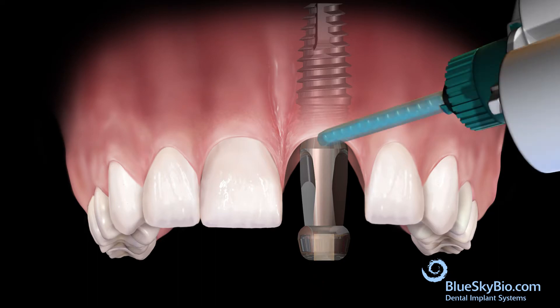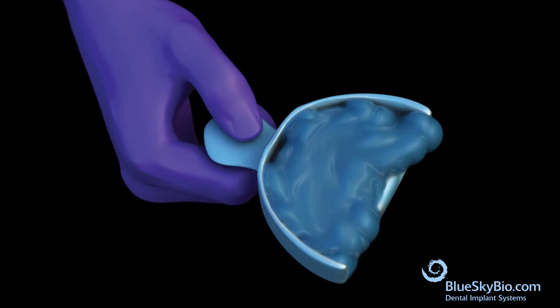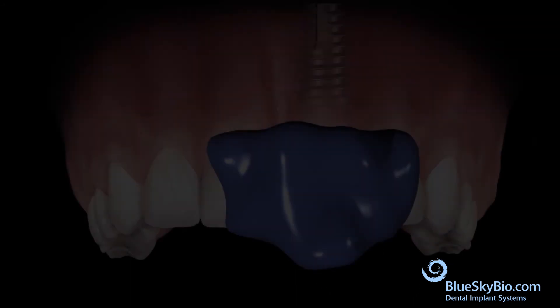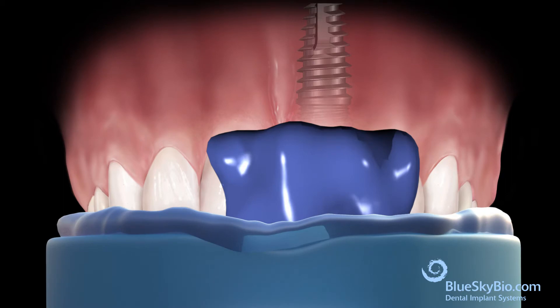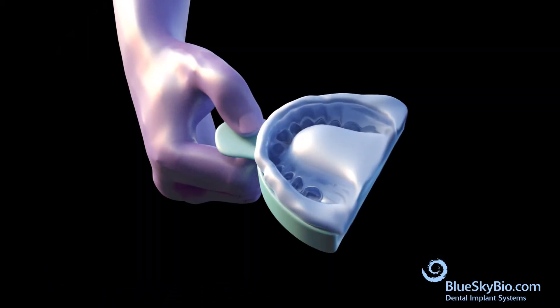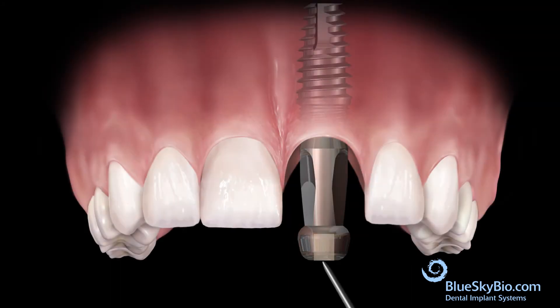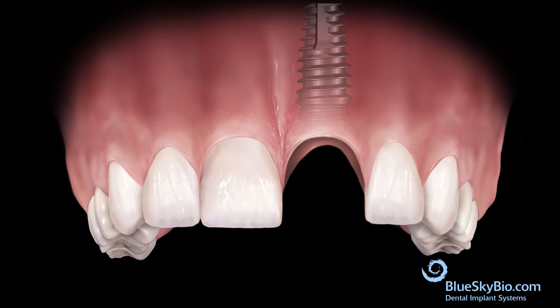Inject medium body impression material around the impression transfer and into an impression tray, then take an impression. After the impression material has hardened, remove the impression. Remove the impression transfer from the mouth and reinsert the healing abutment.